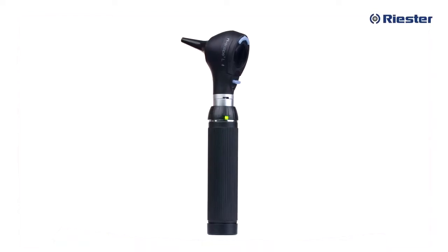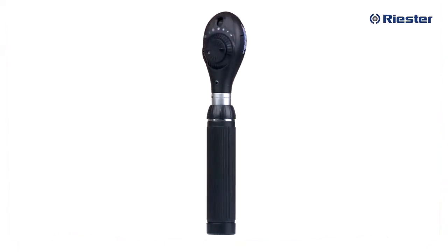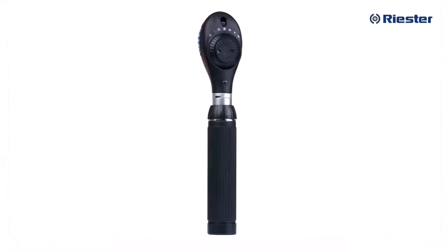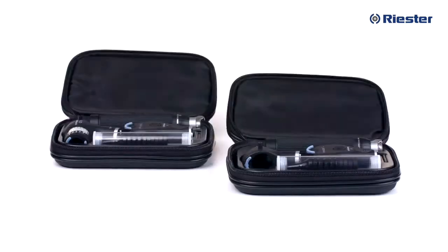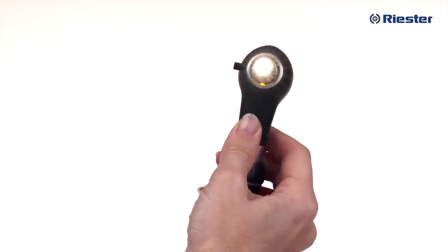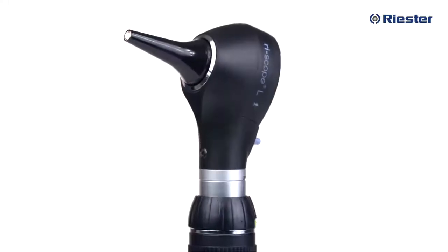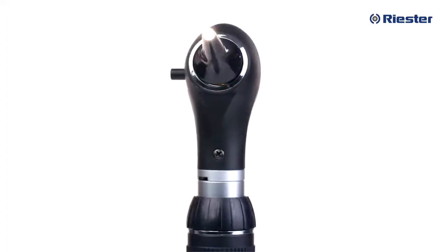Hello and welcome to the Riester family. We understand there are many choices when it comes to diagnostic devices and we want to thank you for choosing Riester. When you receive your Riester diagnostic set, you are getting more than just an otoscope and an ophthalmoscope. You are getting quality devices made in Germany, world-class LED illumination, and the best customer service support, here to help anytime you need us.